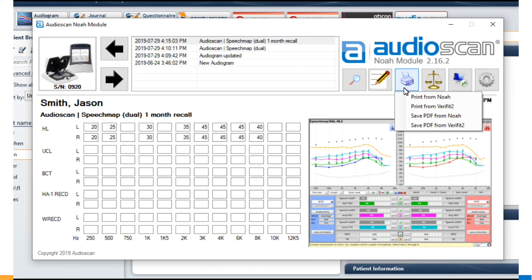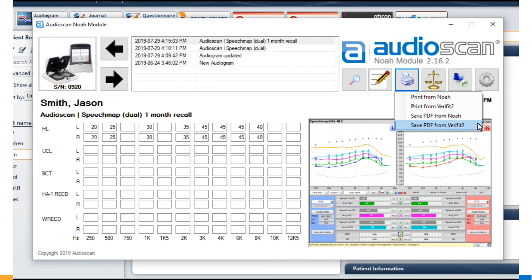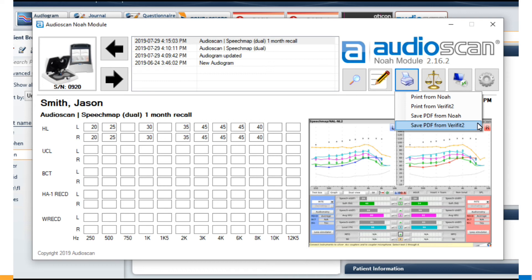Print from Noah, which prints the images stored in the Noah database along with anything else specified in the Noah module print settings. Print from Verifit2 or Axiom, which pulls the print from the connected Verifit or Axiom and includes anything that's specified in the AudioScan's printing setup menu. Save PDF from Noah and Save PDF from Verifit2 or Axiom, which follow the same pattern but will store a PDF file at a predetermined location on your PC. We've even added the ability to predetermine the naming structure of this file for compatibility with EMR systems.